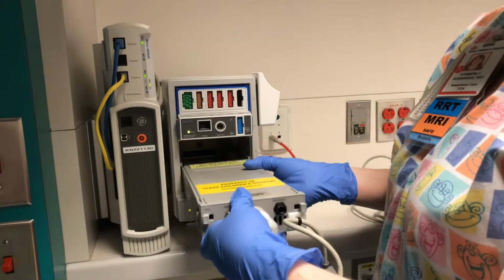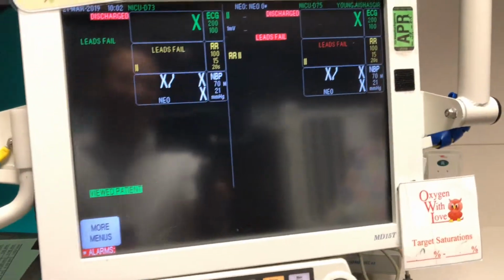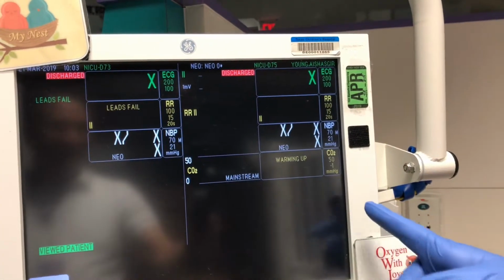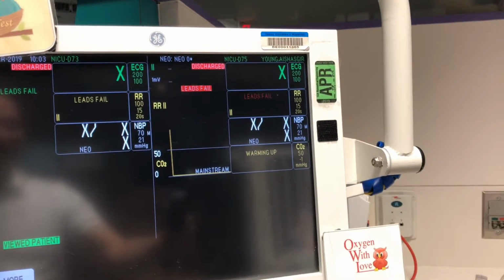Install the tram. You want to push it all the way in. And then on the monitor, it should pop up, but it can take up to like 40 seconds for it to show up. So you now see it here where it says CO2, and it says warming up. And so we wait.